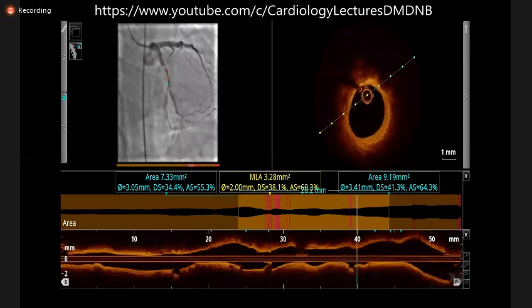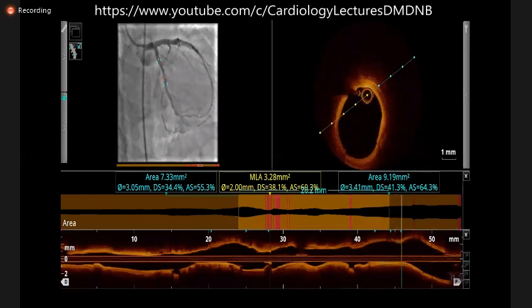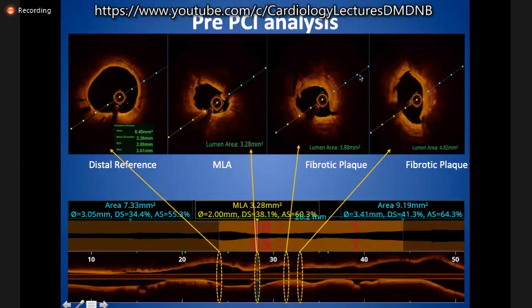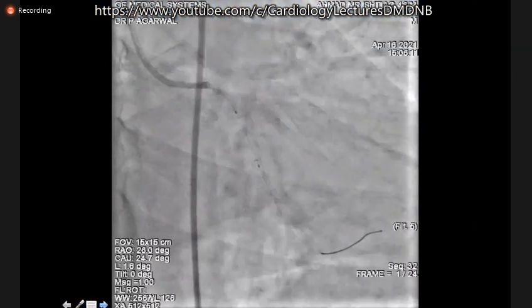Now my bed is ready for my scaffold. Just see the picture. Yeah, you can see all the fibrotic areas, and they have good cuts made by my cutting balloon. And the cutting balloon was very aggressive. Now the device is a 3.5 device, 3.5 x 19.